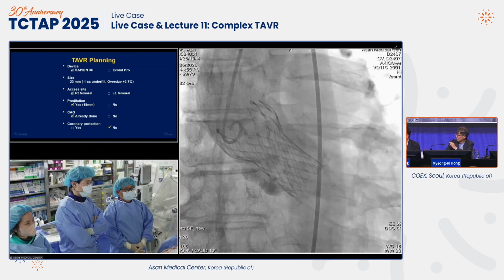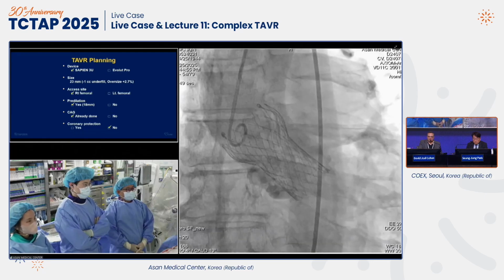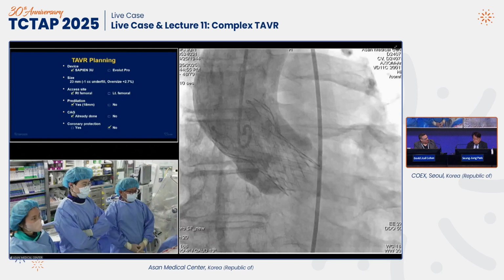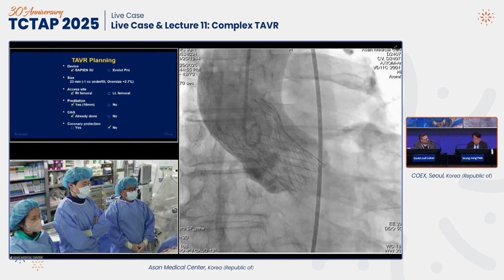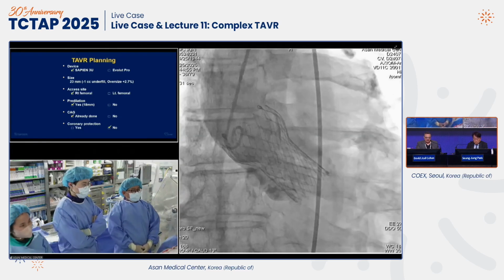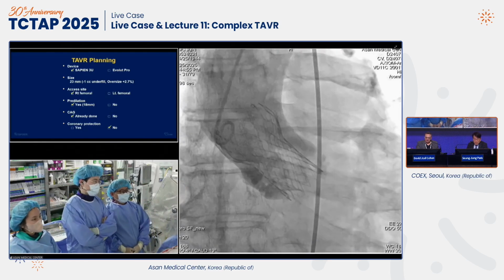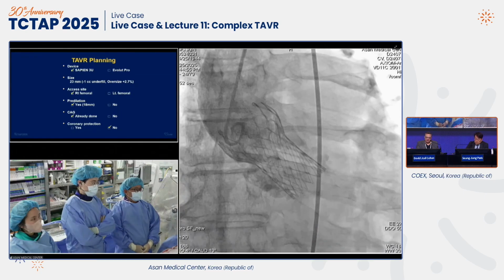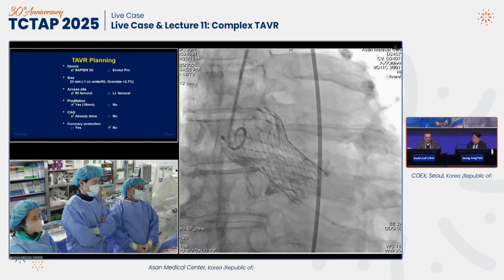If he came in today at age 71 with a bicuspid like that, I think, and this is not necessarily so relevant, but is there anyone around the table who, if this patient came at age 71 with a type 0 bicuspid, would be thinking TAVR first? So perhaps there was some extenuating circumstance at that time, but I think it's a very interesting case. You're lucky that you have very large sinuses, so coronary obstruction isn't a big issue. Is there commissural alignment here, just offhand? Did anybody notice on the CT?